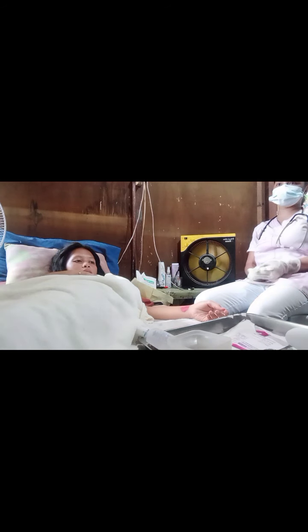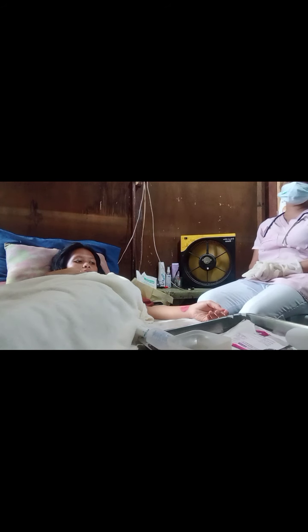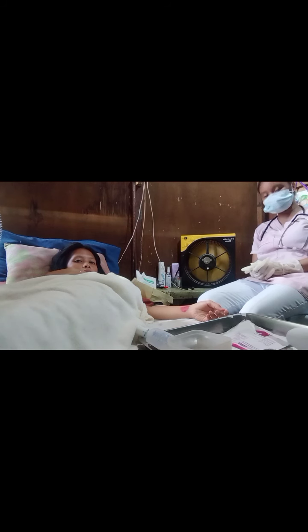After drying the wound, I'm not gonna cover it with loose gauze. I'm gonna use this pre-cut 4x4 size gauze as a contact layer of the wound.